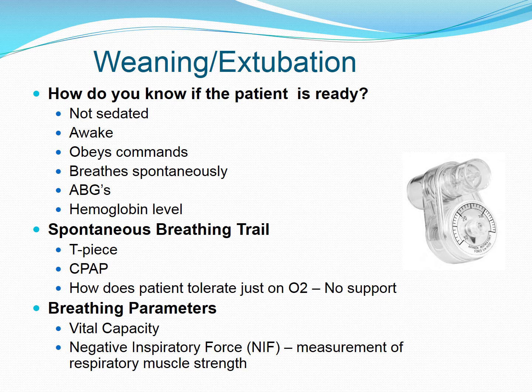And so what happens is they connect tubing to the trach, and then that tubing is connected to oxygen on the wall, and it is humidified oxygen. Basically what you want to do is monitor these patients' vital signs and their oxygenation level when we do this. If any signs of respiratory distress develop, then the patient is put back on the ventilator.